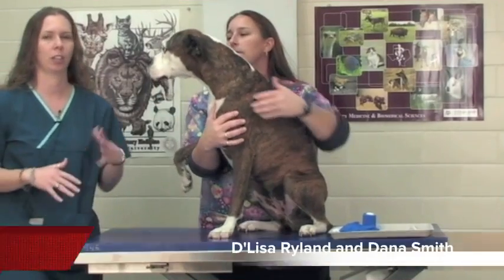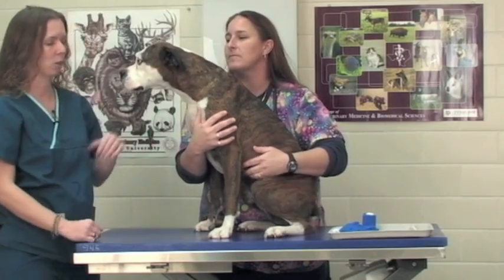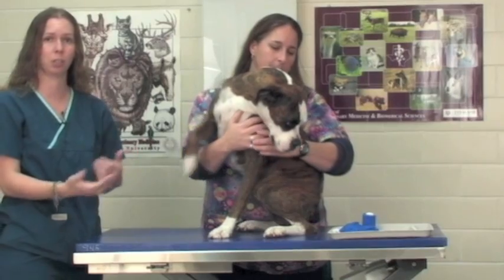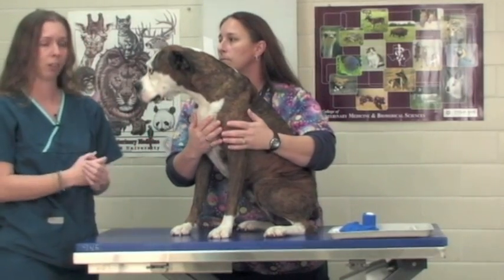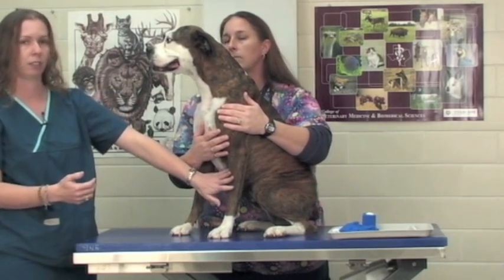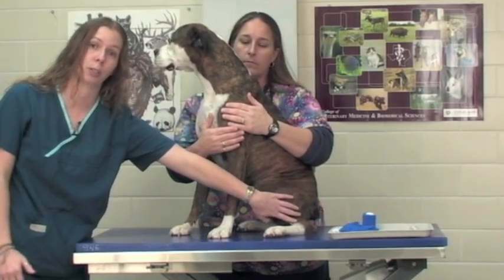We're going to go over the procedure for drawing blood from your patient. We have our patient Winn-Dixie here and we're going to go over some of the locations that you would draw blood from and then the procedure that you would use. There are many vessels that we can draw blood from. Some of the most common are our jugular vein, our cephalic vein, and our lateral saphenous vein which is on the rear leg of our patient.